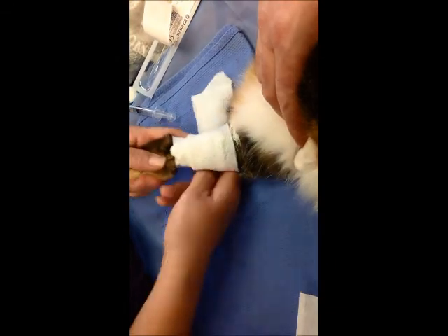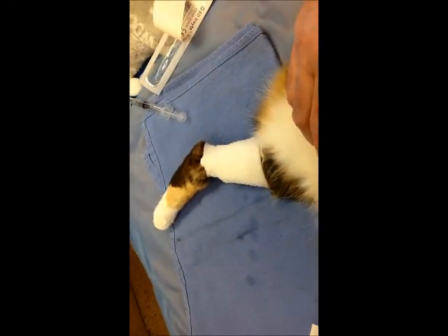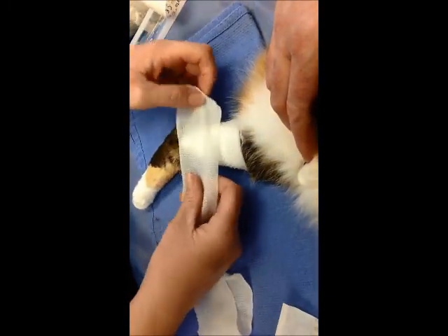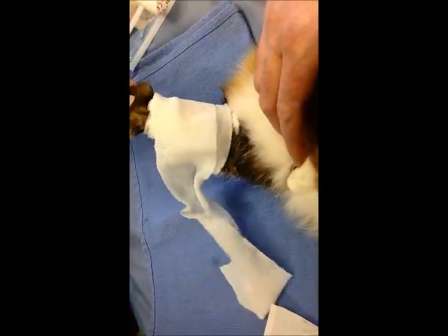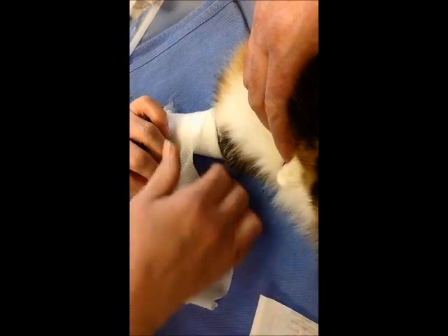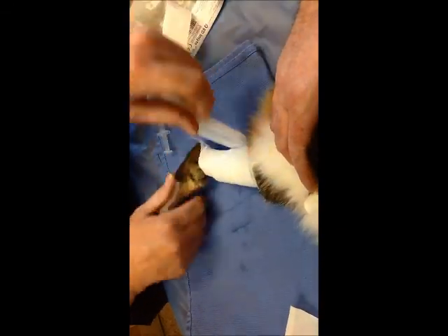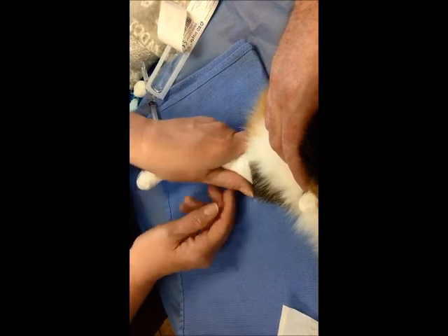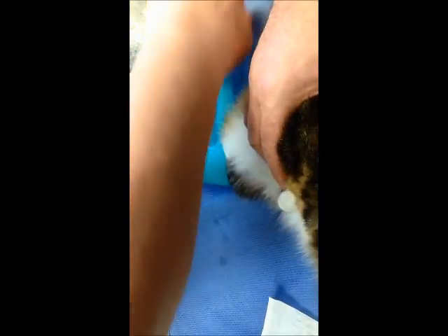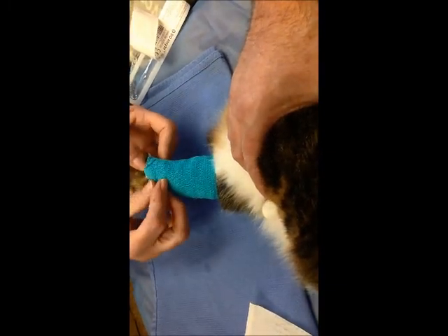Small amount of bandage material. Kind of sticks to my hand a little bit. And the port is still available for intravenous use.